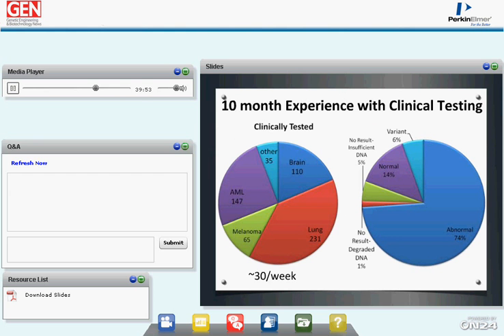In terms of diagnostic yield, in about 75% of them, we're identifying at least one disease-associated change. So this means when we look across the literature that the mutations we see in the specimen have been reported previously as a pathogenic change in some tumor type. And so this is a really high number. Only 14% of cases are coming back normal, meaning we haven't found what it is we're looking for, and this just means we need to expand our content in our future versions of the panel.